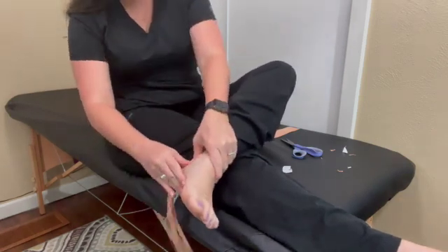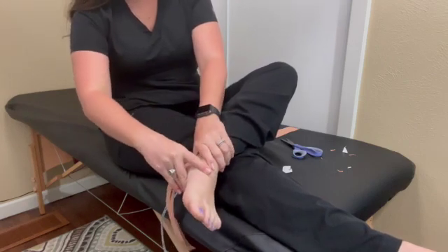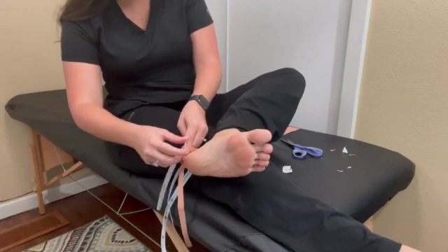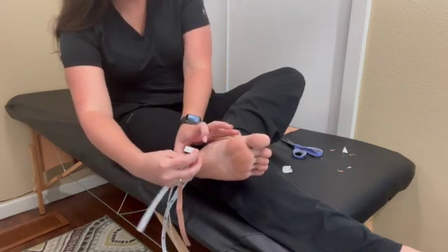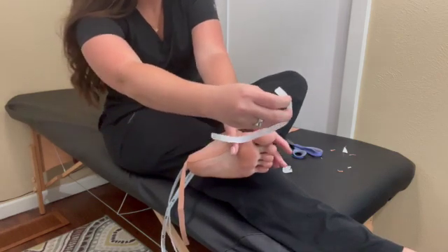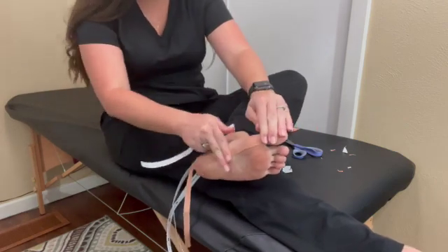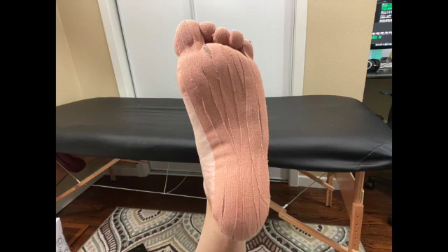I anchor the tape at the distal calf and posterior ankle first, rub to activate the adhesive, then go strip by strip — removing the backing with the foot in dorsiflexion — and apply each strip with no tension along the foot. Each tape strip runs along the plantar surface of the foot and over the top of the toe, anchoring onto the toenails. I'm covering as much skin surface as possible; the big toe required three strips while the other toes only needed one.